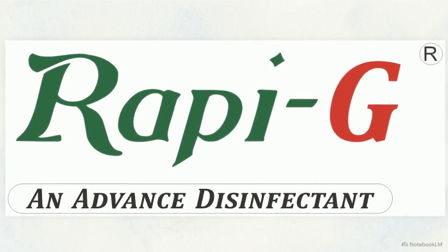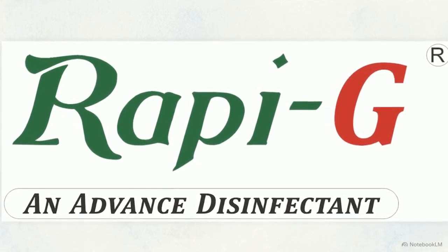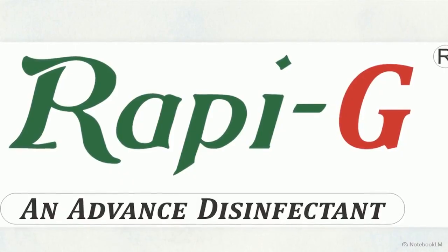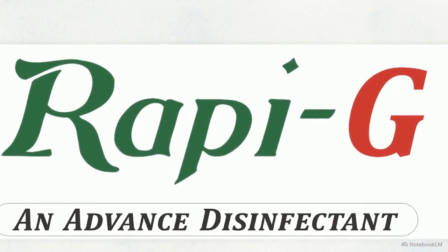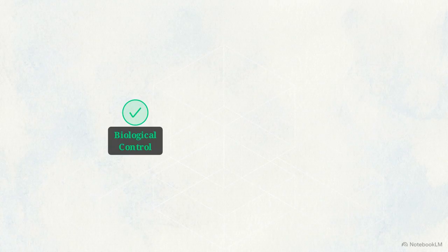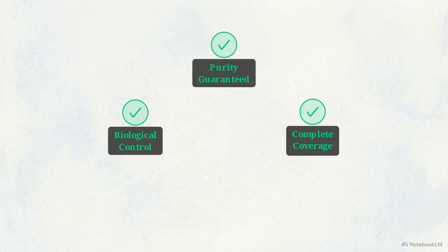Welcome to the standard operating procedure for the Rapi-G system. This validated chlorine dioxide gas technology is designed specifically for critical industrial hygiene. The goal of this procedure is to achieve three specific outcomes: broad-spectrum microbial sanitization, uniform gas distribution across your entire facility, and a completely residue-free environment.